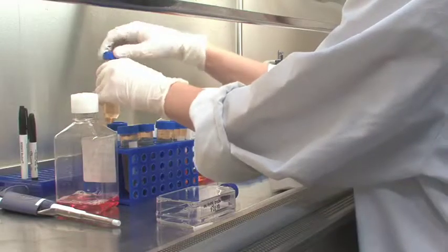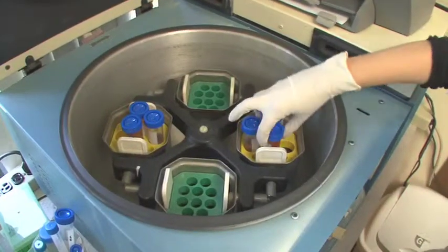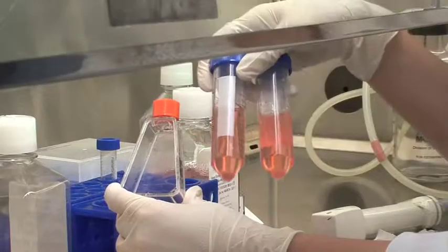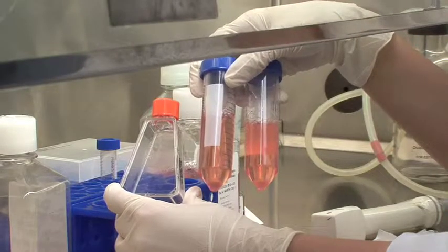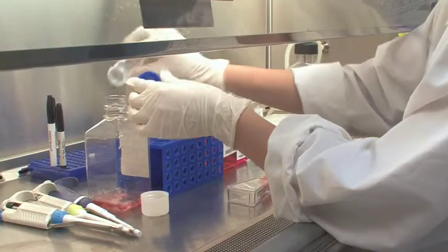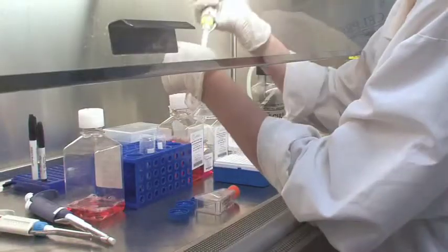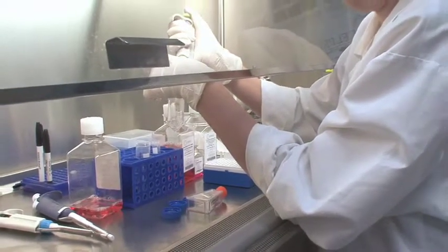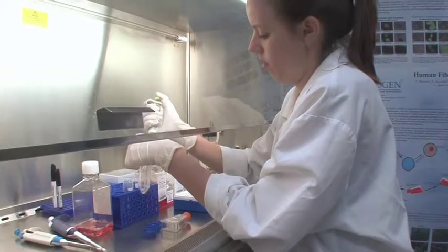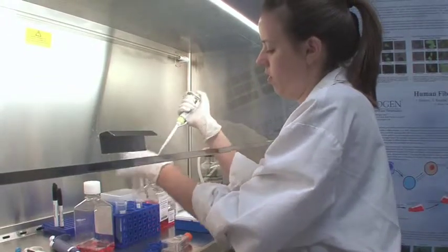Acquire the 6 conical tubes of suspension cells created in Part 1 and centrifuge for 7 minutes at 100 G. The T25 version will have 2 conical tubes. Safely discard the 100% supernatant media. Reconstitute the cells in 1.7 milliliters of complete growth media per 50 milliliter conical tube. Note, in the T25 version of the protocol, use 3.5 milliliters of the complete growth media.